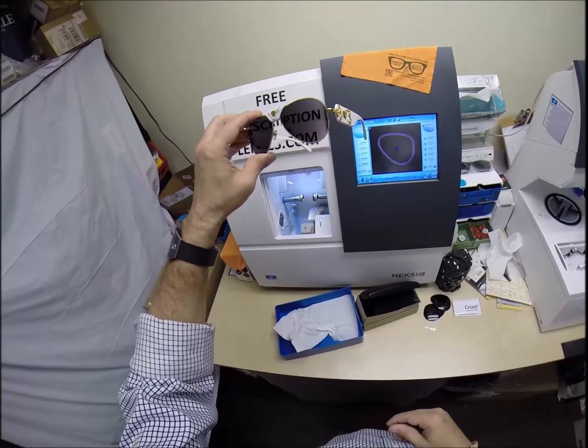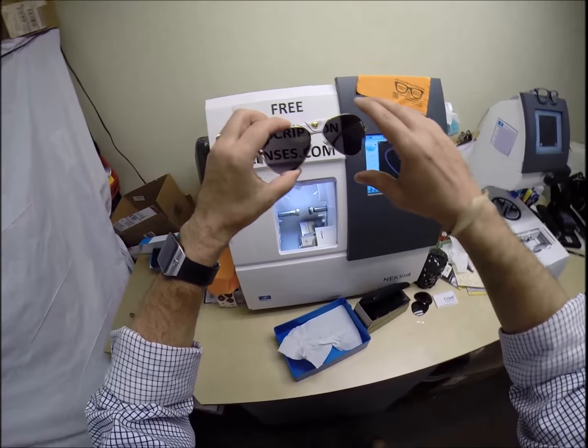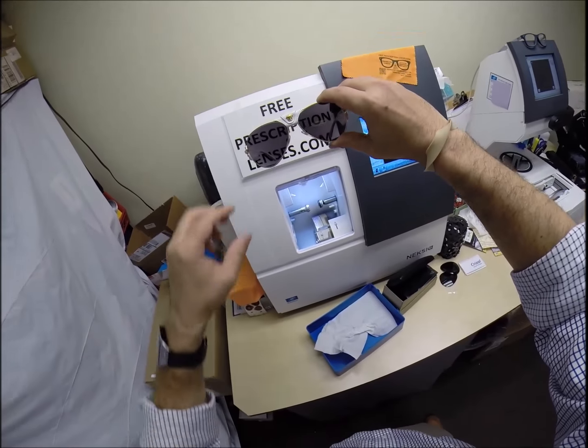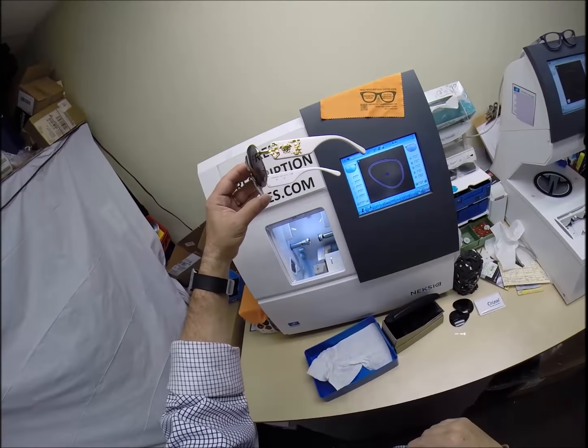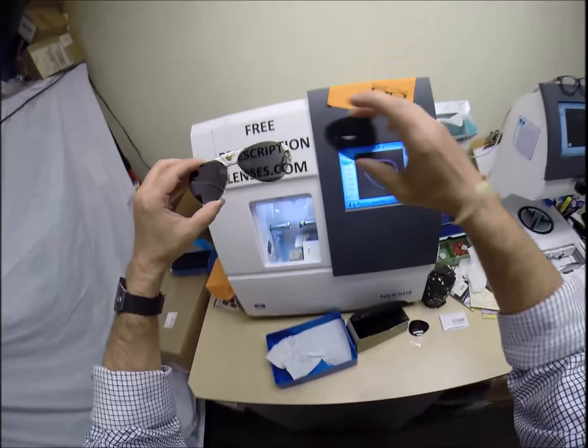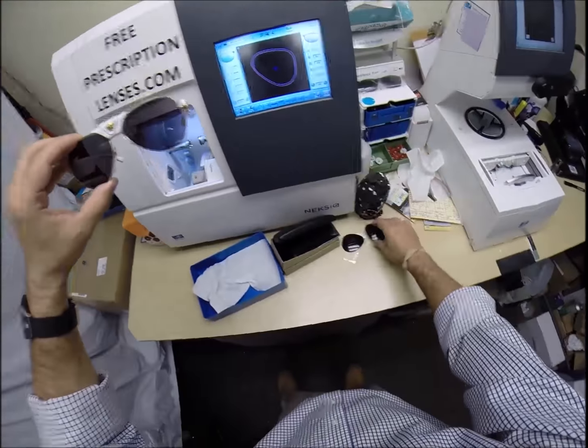So that is what they look like the first time they've been activated. Don't worry, they're going to keep getting darker and darker. Come on, Zeus, we talked about that. Don't you remember? This is what the frame looks like the first time they've been activated. This is tough. They will get as dark as this, don't you worry.